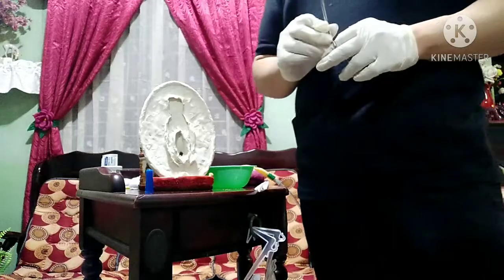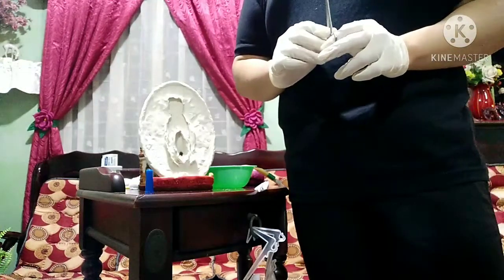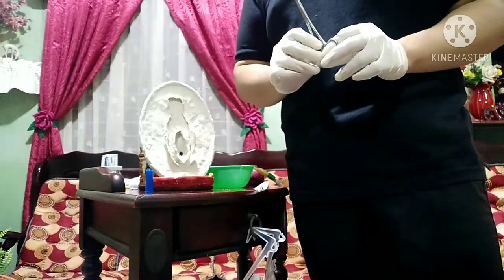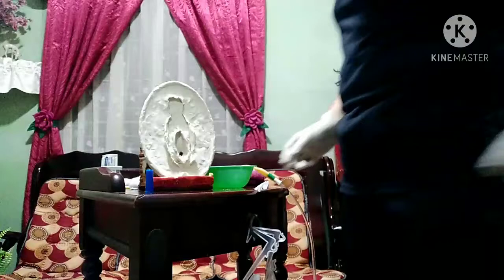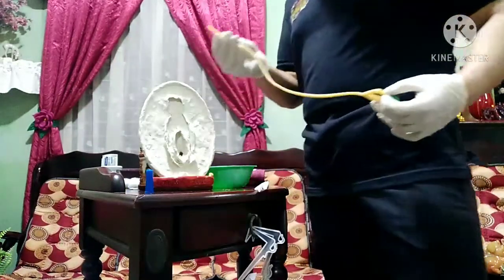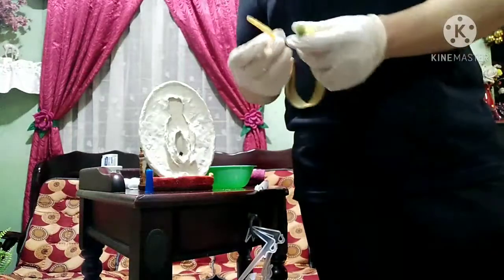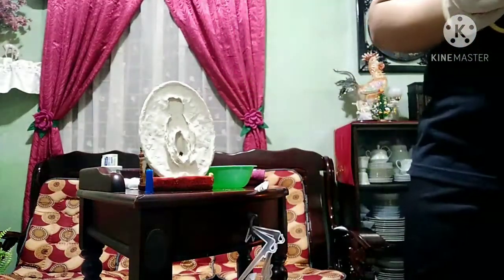So, inspect the catheter po to be sure no remnants remain in the bladder. If the catheter is not totally intact, report this promptly and save the catheter for further inspection po. So, ayun po, i-check po natin yung catheter po natin, kung ano po yung kanyang kalagayan po. So, ayun po.